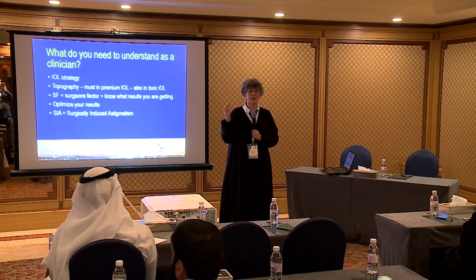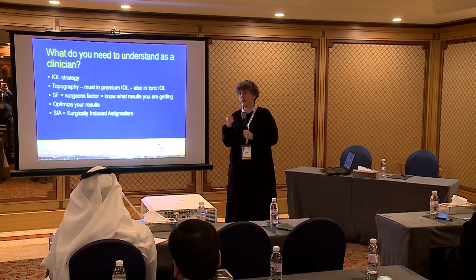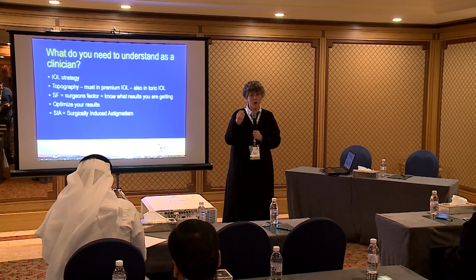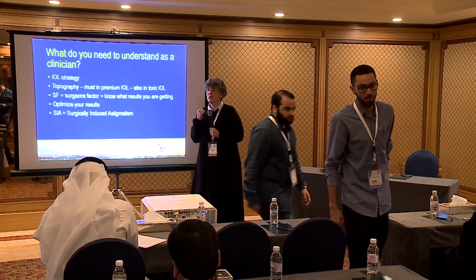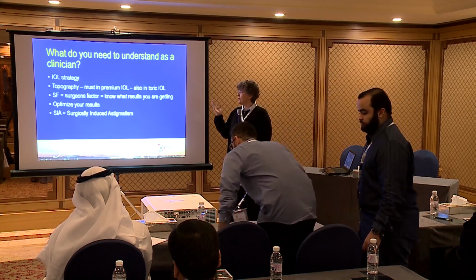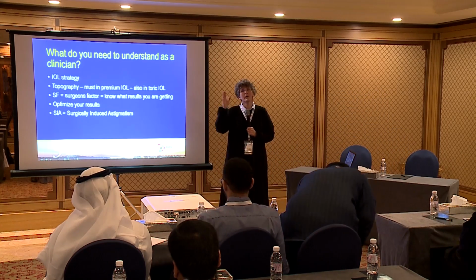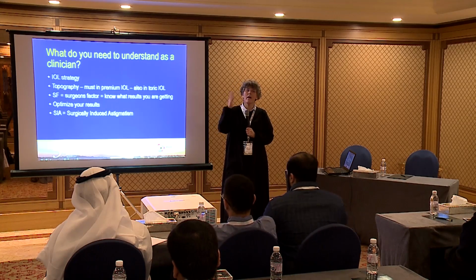Do we put in the same lens? Did we have a look at our own results? It's worth doing it because you're optimizing for the systematic error that's in your own clinical practice, okay? But if you don't, you will still have good results, but with a systematic error, a little bit off to one side or the other every time and again.